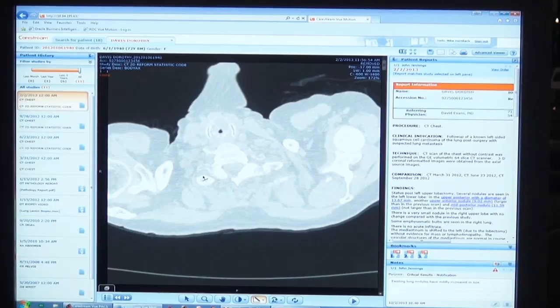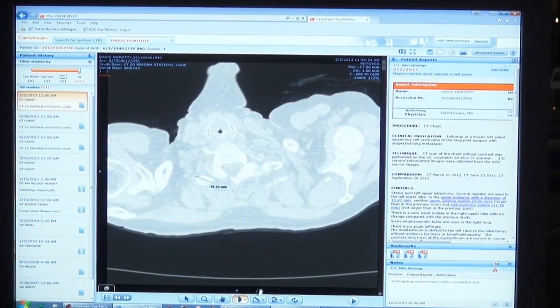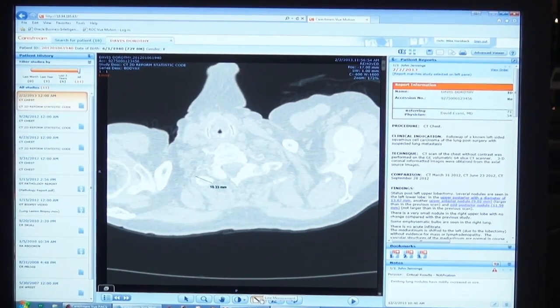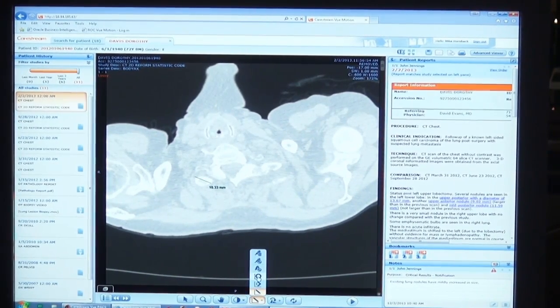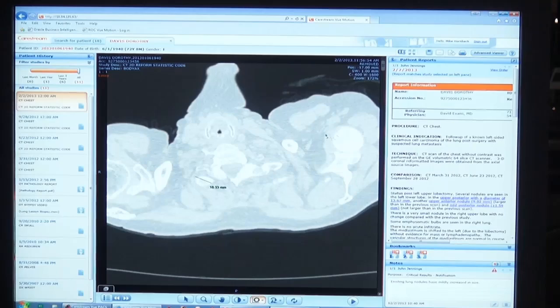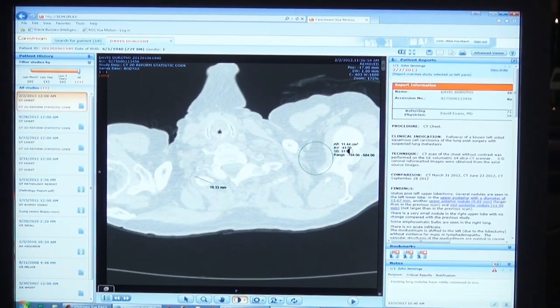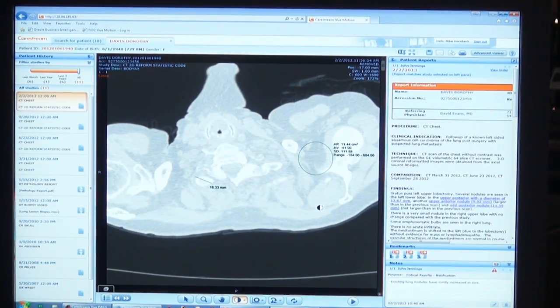In addition to the line measurements we had in our initial release, we've also added region of interest measurements, giving the area, average, standard deviation, and the range.